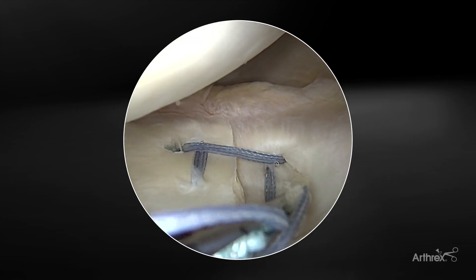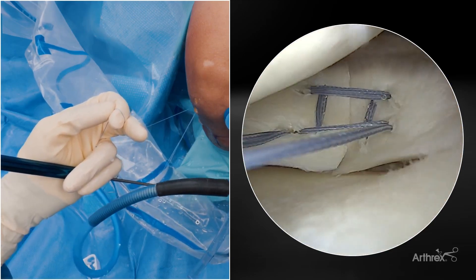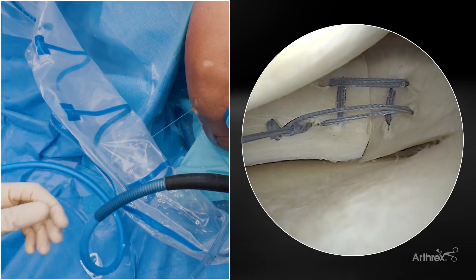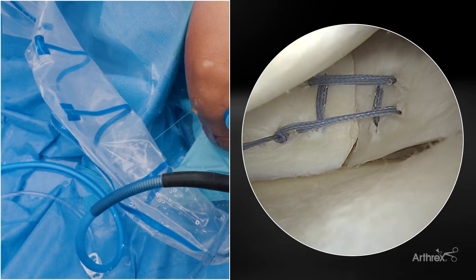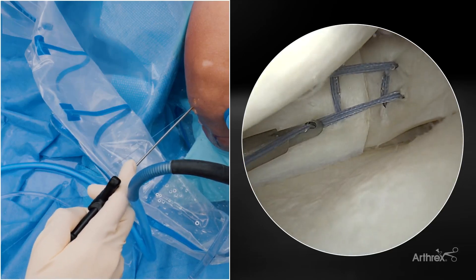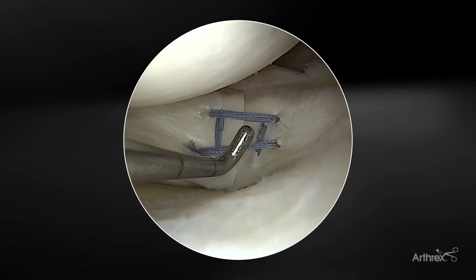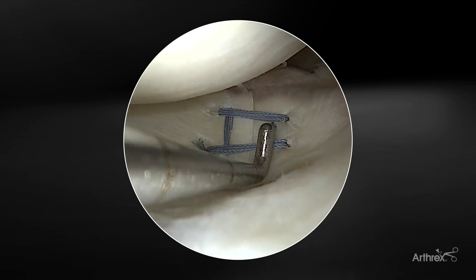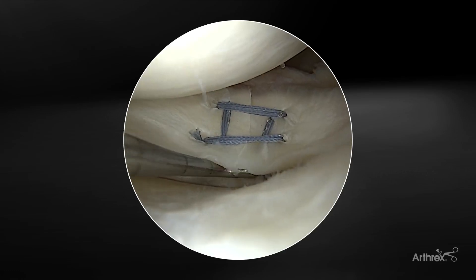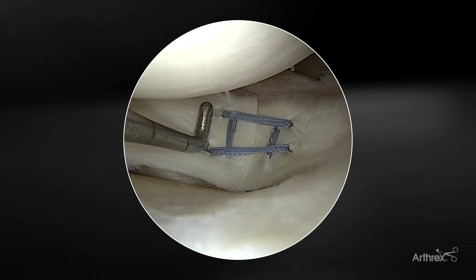Here we're going to place our more central stitch. We can see the initial tensioning of our more central stitch coming out really nicely. I don't mind a little bit of over-tensioning on radial repairs, because in case there is any loosening with weight-bearing and compression — which I restrict for the first six weeks — I like a little bit of over-reduction initially. Here is our final introduction with the knot pusher cutter for final tensioning and cut. So this is our final construct: our ripstop sutures — because clinically, these edges of the tear are typically a little bit friable, giving a mop-end appearance — sometimes require positioning the ripstop stitches a bit further away, but try to get them as close as possible without ripping through.